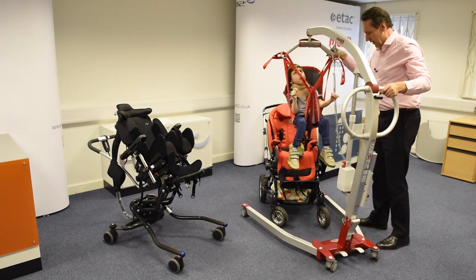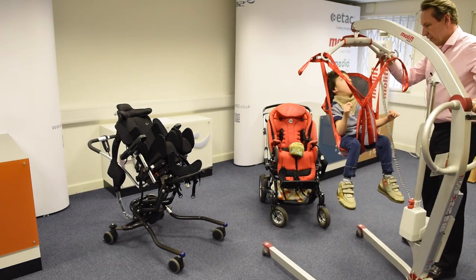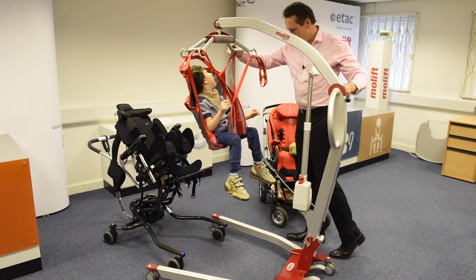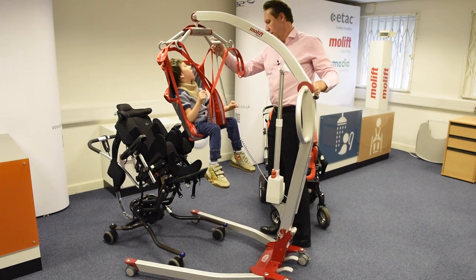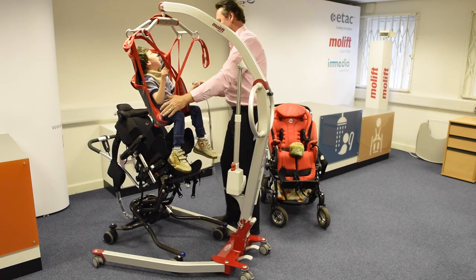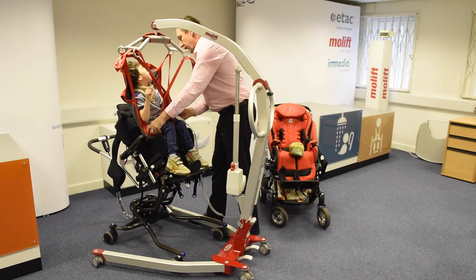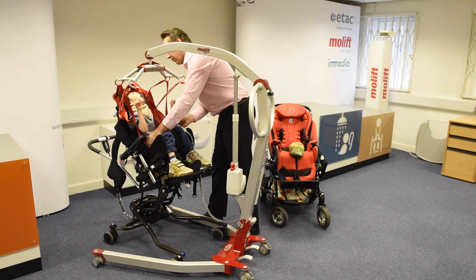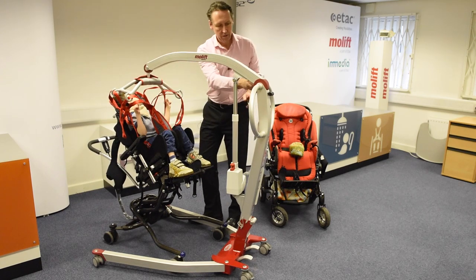So once we've got you in the air, we're now going into the expander. And you can see it's very, very reclined at the moment, and that's going to help us get you in a good position. As you can see, as your head goes back, the straps release with you.